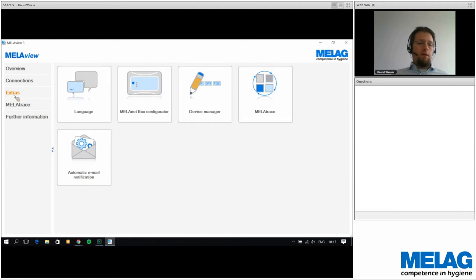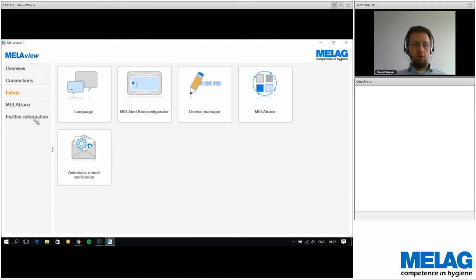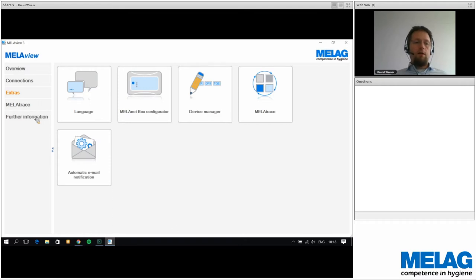There is also the MelaTrace button on the left-hand side to start the software, and under 'Further Information' you can find the operation manual as a PDF — useful when something isn't clear during setup.